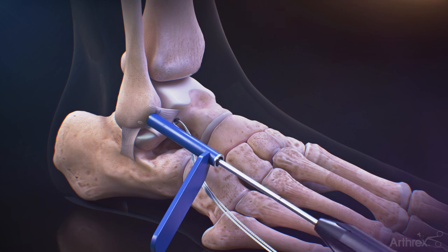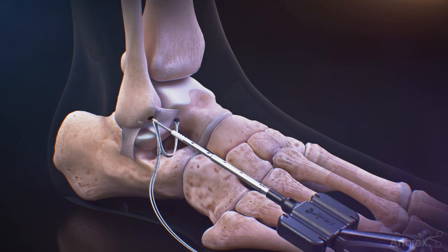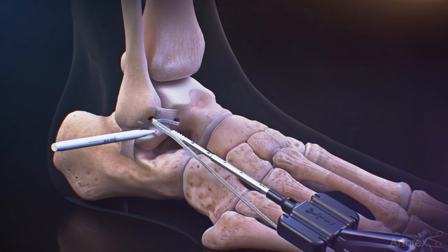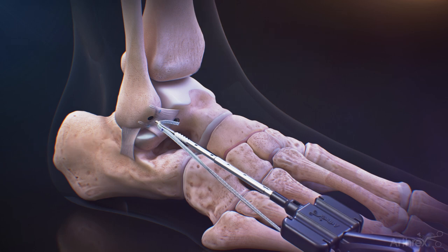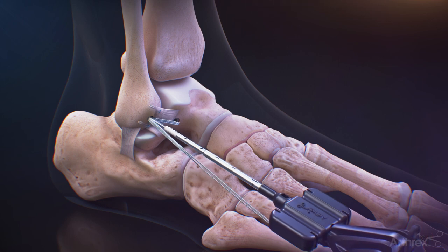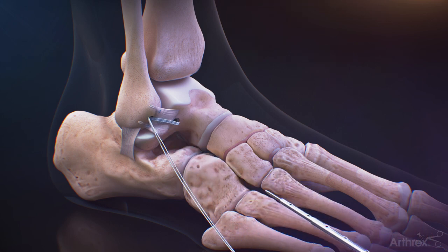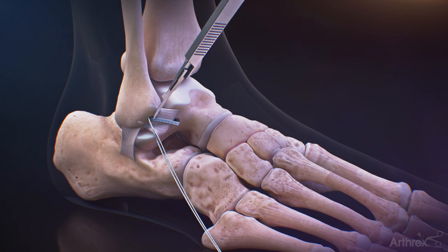Remove the tap and guide. Load the fiber tape for the internal brace in the 3.5 mm swivel lock and place the eyelet at the fibular hole, pulling the fiber tape taut. Use a marking pen to mark the fiber tape tail even with the laser marking on the inserter, then pull the eyelet back on the fiber tape to the mark. Insert the 3.5 mm swivel lock, then cut the fiber tape flush to bone and the all-knotless ligament repair is complete.